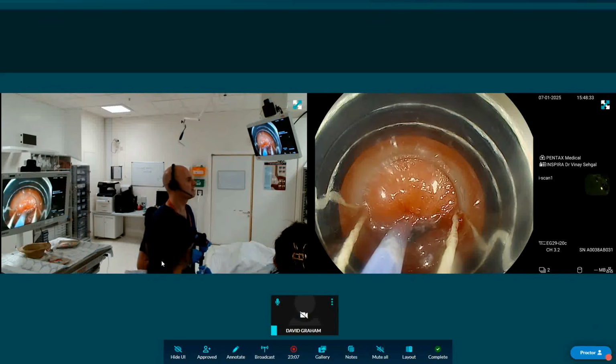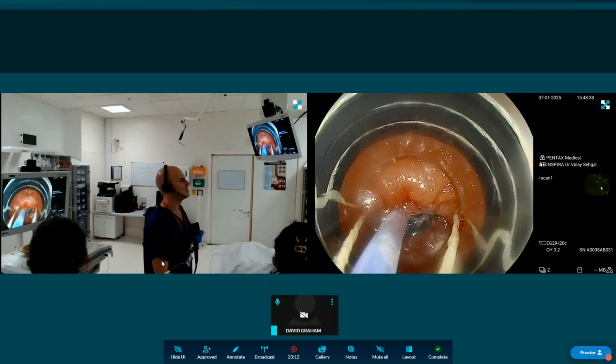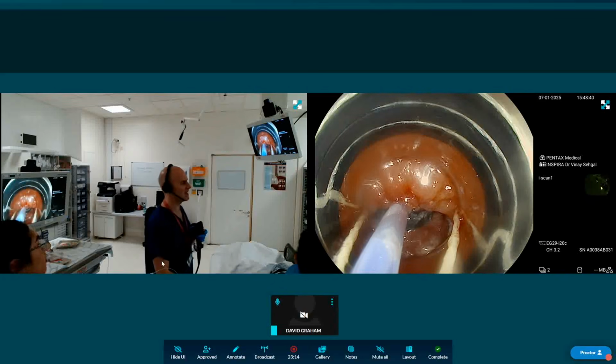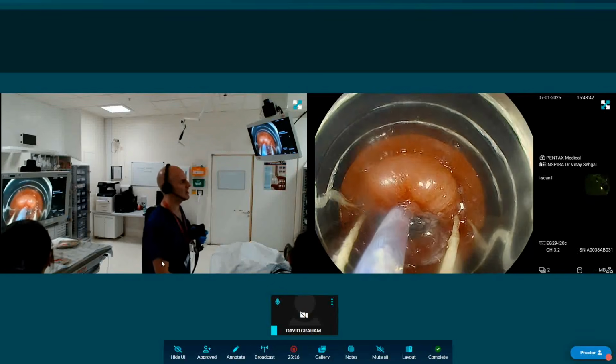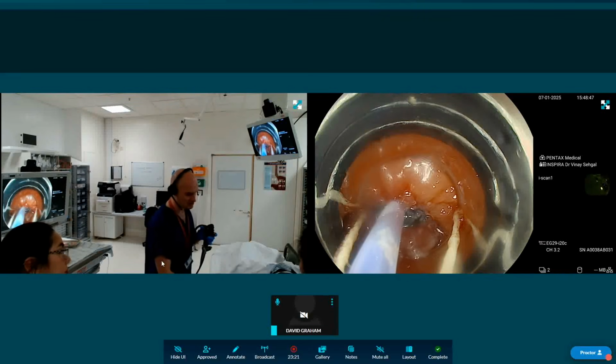Thanks Giselle, try that. That looks better, doesn't it? Looks like on scope. So now you want to hyperinflate the esophagus, which takes any muscle fibres out of the elastic band. Now we suction down the esophagus and take the tension away. We make sure our snare is straight, which it is.